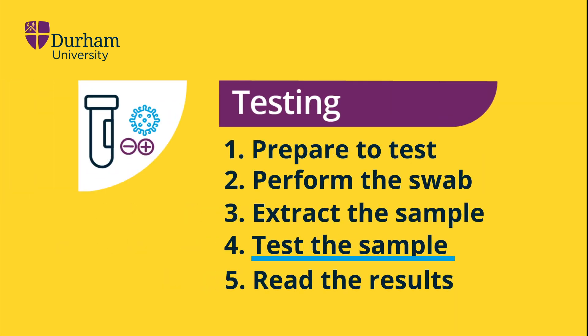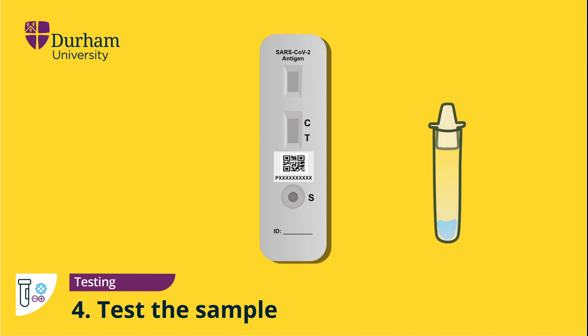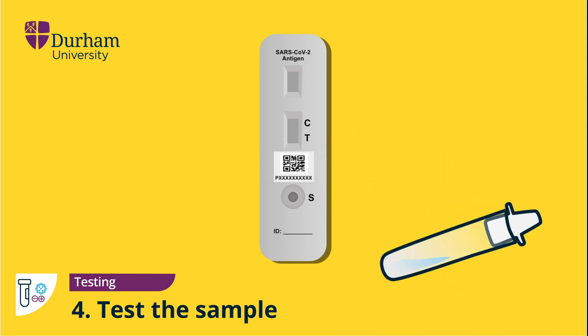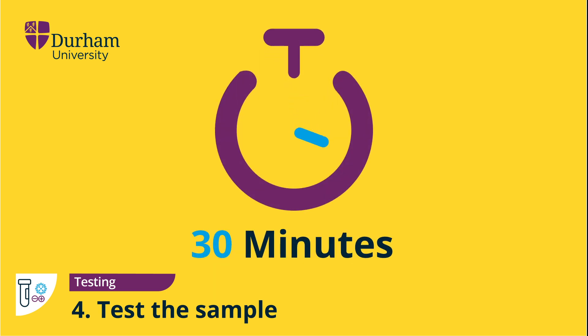Testing the sample. Remove the testing device from the packet and place it on a flat surface. Carefully apply two drops of fluid from the tube onto the testing device sample well marked S, making sure not to drop any bubbles of air that may be in the bottle. Place the tube down but don't discard it in case you need to repeat the test. Set a timer for 30 minutes.